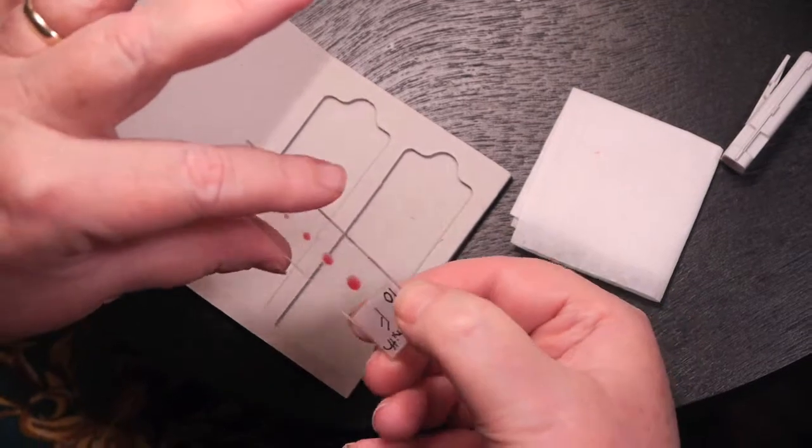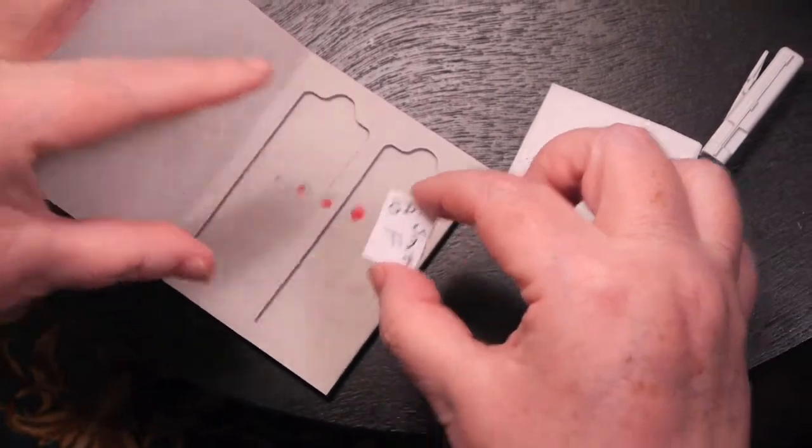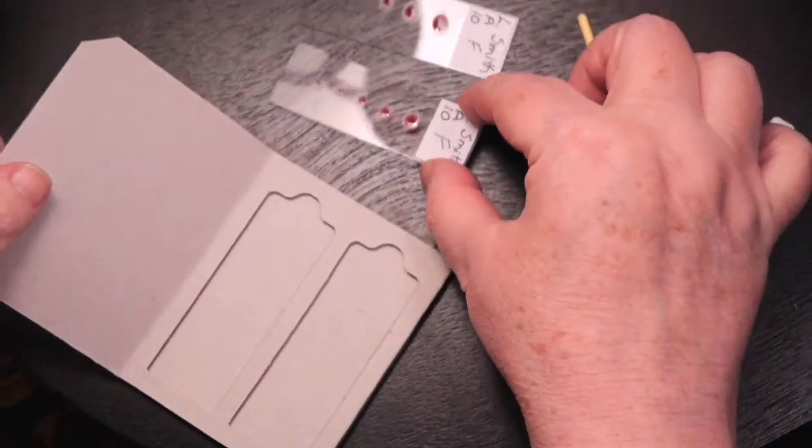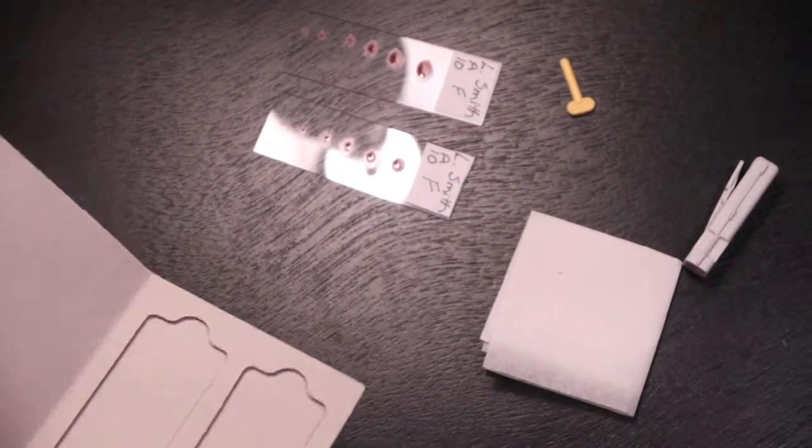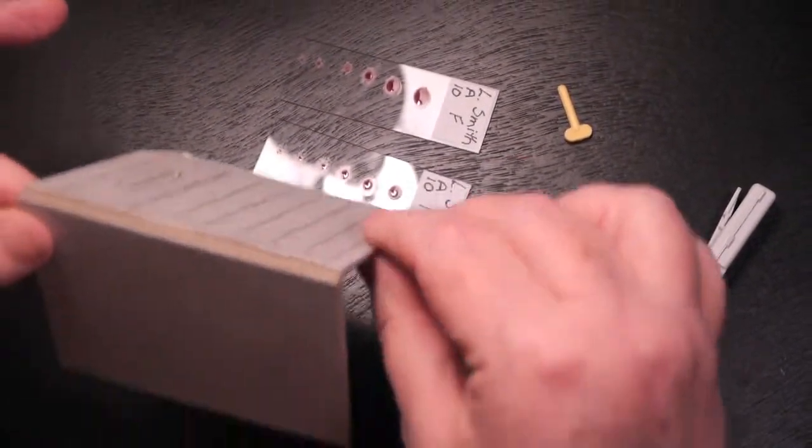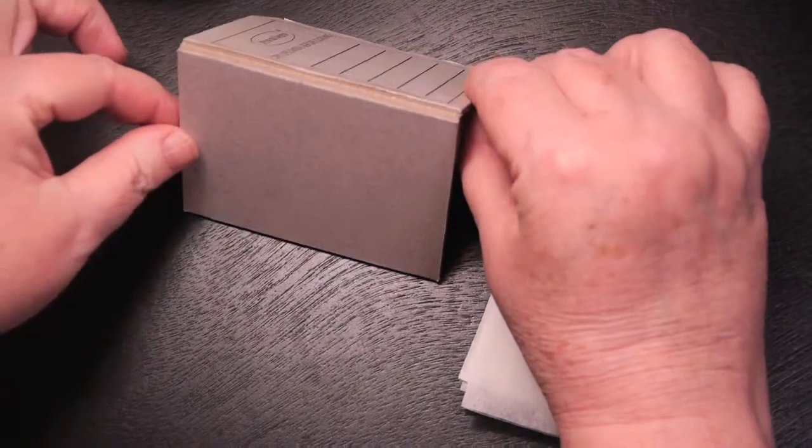We'll need to let this dry before we package it up and mail it back, so just cover it with the case and we'll let that sit for 10 or 15 minutes.